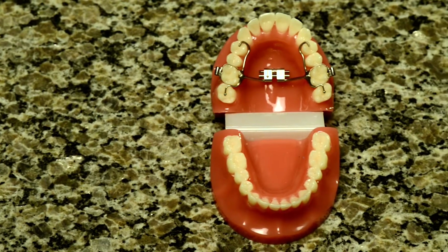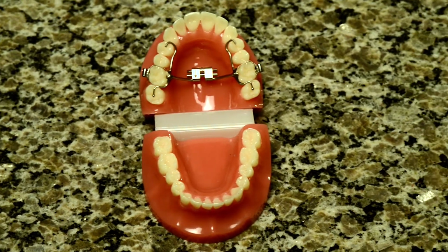RPE stands for Rapid Palatal Expander. Rapid because we're asking you to do 1 turn per day. Palatal because the 2 bones being expanded are the palatal bones, which form the roof of the mouth and the floor of the nose. Expander because you will be expanding 1/4 of a millimeter per day, so it will take 4 days to open 1 millimeter.